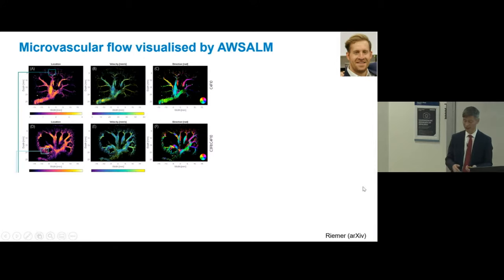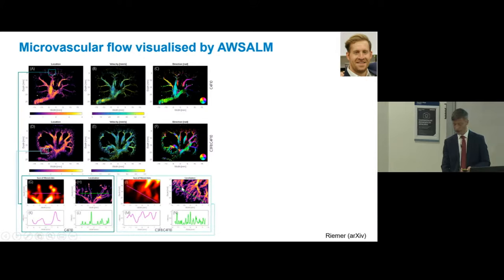Kai has really done a lot in this study. He showed these wonderful images, but the key thing here is that we resolve the vessel much, much better than the state-of-the-art microvascular imaging technology, and you can see the difference. Also, what is really important is these images require data acquisition of only a few seconds rather than the tens of seconds or minutes that's often required for the current imaging. So that's really a major achievement.